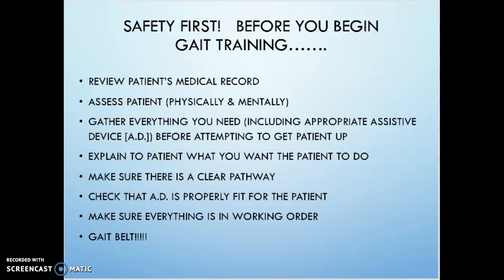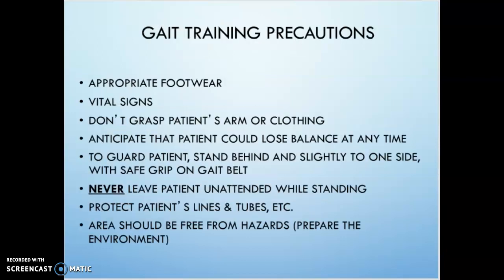Of course, gait belt with a palm-up grip. We do not ever want to be walking a patient without a gait belt unless they have progressed dramatically and we have ensured that it's not needed. Certainly, the first time we are walking with a patient, a gait belt will absolutely be required.